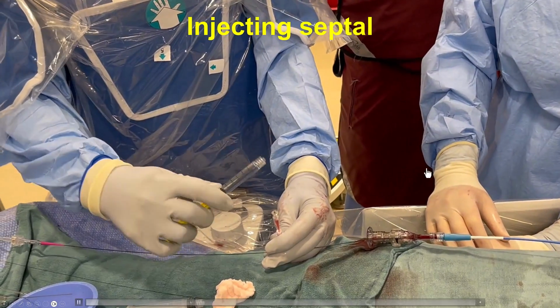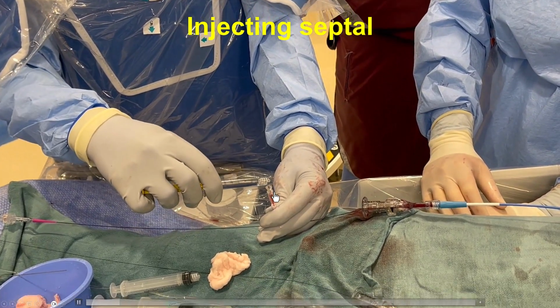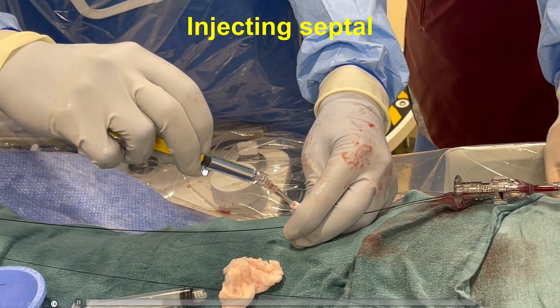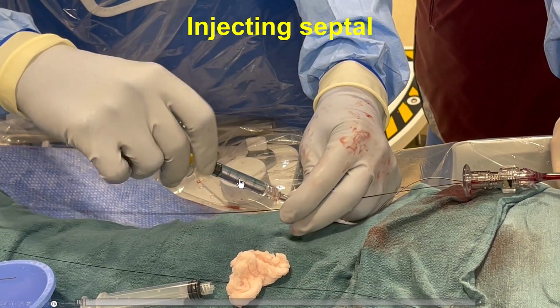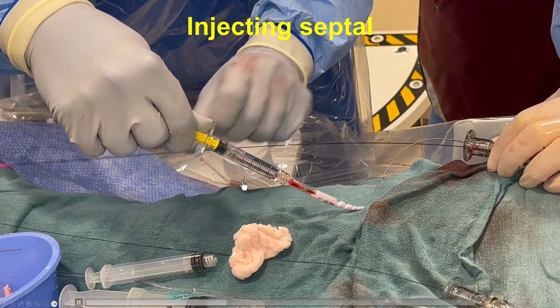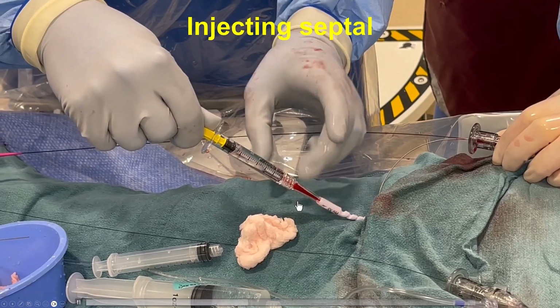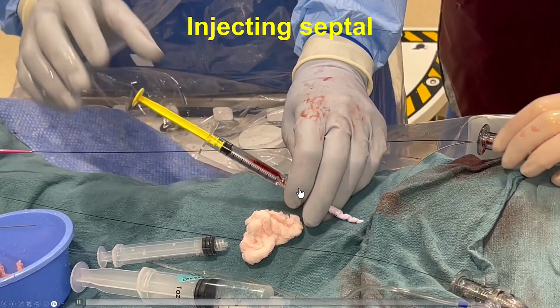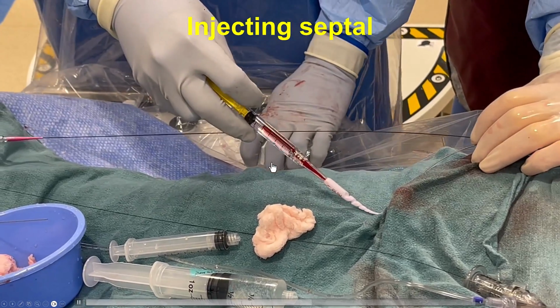This is an example of the contrast-guided technique. We advance the microcatheter inside the septal, and then we connect a 3 cc Medallion syringe. Medallion is less likely to break compared with the standard 3 cc syringes because we do exert quite a bit of force. We aspirate. We want to see good blood coming back into the syringe.